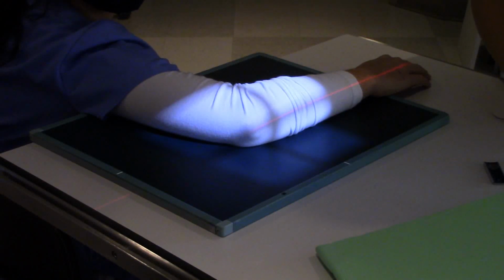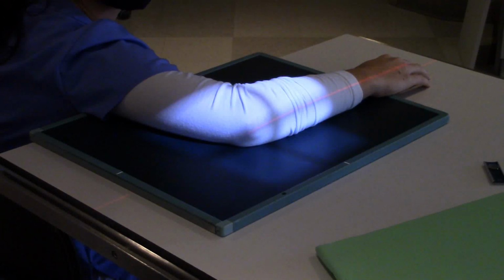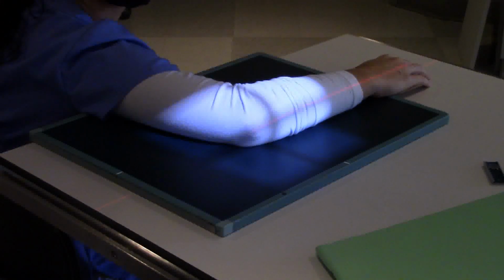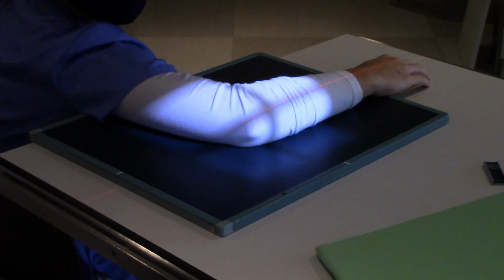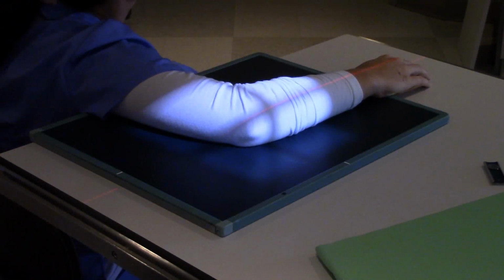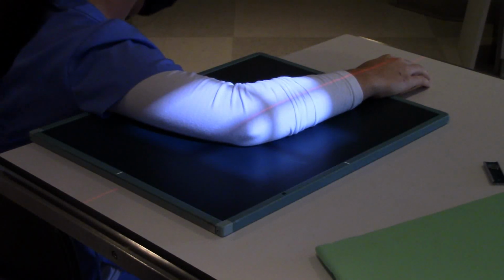Mm-hmm. It's a little low. I want you to raise your central ray somewhat so that it's more towards that, like bring it up so that we're going through that. Nope, other way. The Coyle method. Yeah, see, you want, see where the humerus is right here?